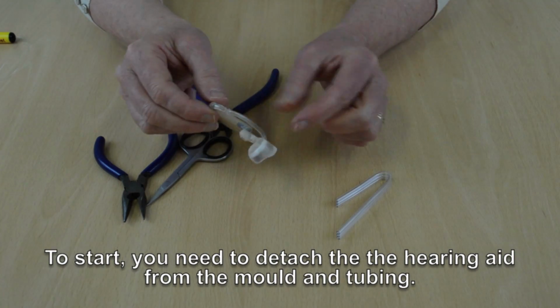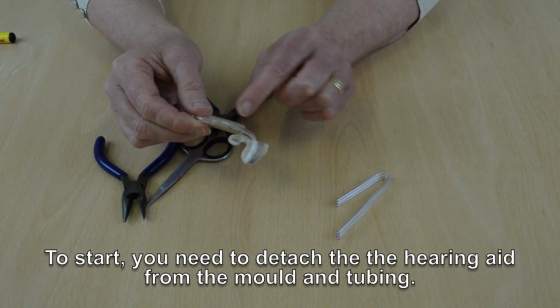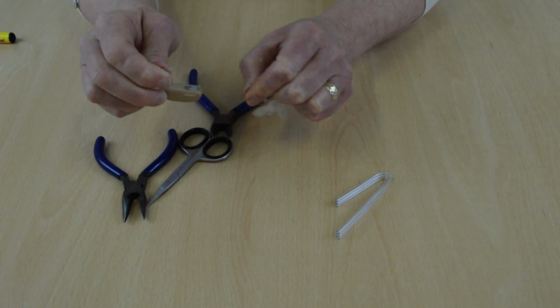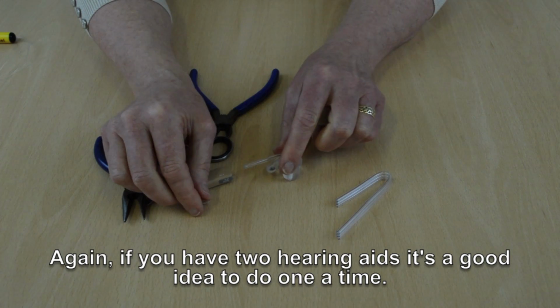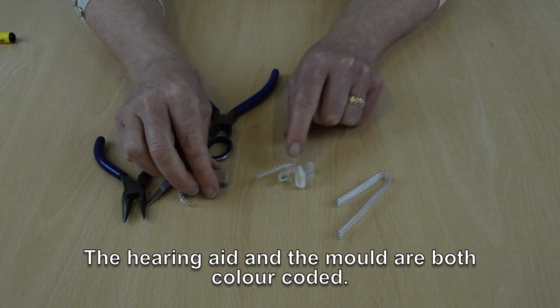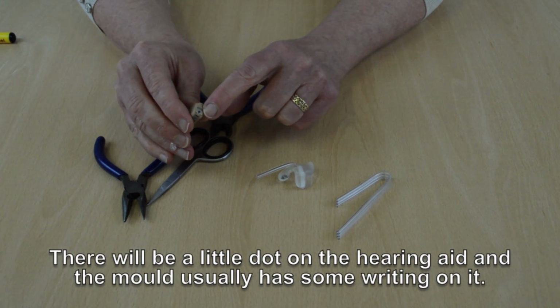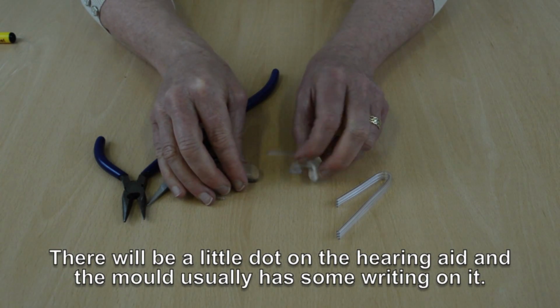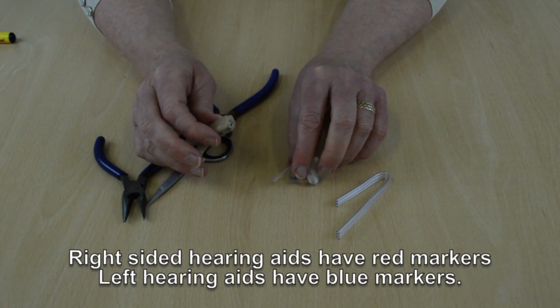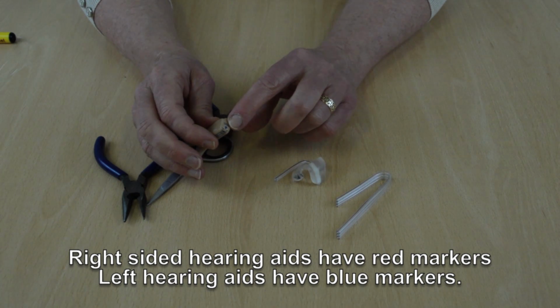To start off with, what you need to do is detach the hearing aid from the mould and tubing. Again, if you have two hearing aids, it's a good idea to do one at a time. The hearing aid and the mould are both colour-coded. There'll be a little coloured dot on the hearing aid to show which side it is, and the mould usually has some writing on. Right-sided hearing aids have red markers and left-sided hearing aids have blue markers.